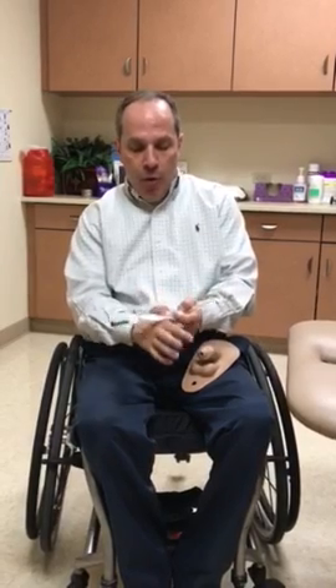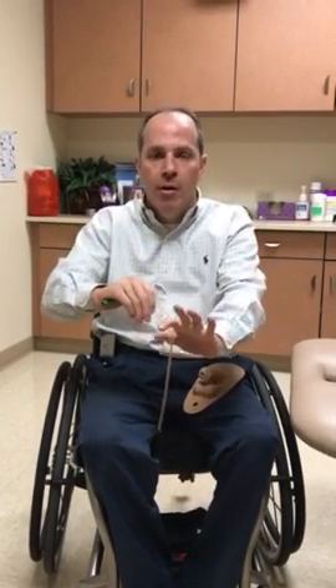One thing I like to teach: once it's in the bladder, before taking it out, pinch it and grab it over on itself — no matter what catheter you're using — then pull it out, because that column will still have urine in it. Drain it into wherever you are draining, let it drip in there, then throw it away and go.